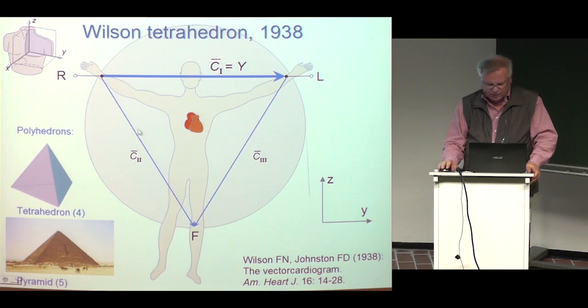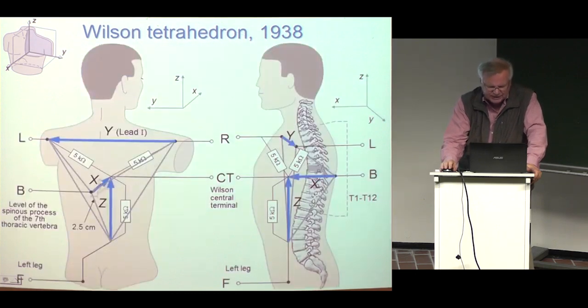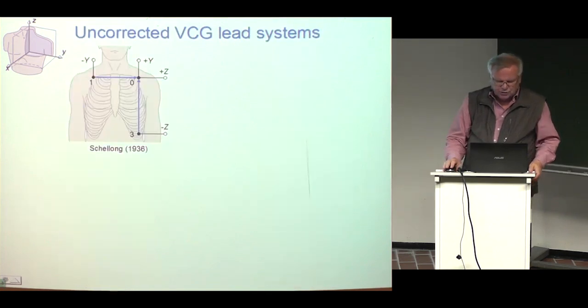So the idea, the word tetrahedron, which Wilson used, is that he imagined that the recording points joint in the space form a tetrahedron. So he started from the Einthoven leads, and the Y lead is just lead one, pointing towards the direction of Y coordinate. Z lead is from foot to his central terminal in the direction of Z. And X lead, which is pointing forward, needs an electrode, which is just the tip of the tetrahedron. Very difficult to find. It is on the back level of the spinous process of the seventh thoracic vertebra, 2.5 centimeters to the left. That's where it is located. Wilson tetrahedron was used quite a bit before better systems were developed.